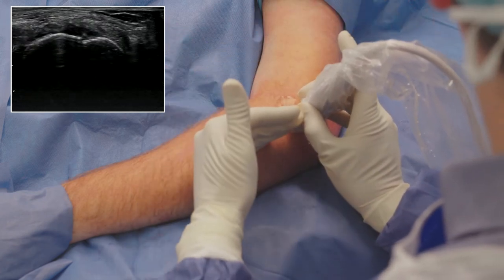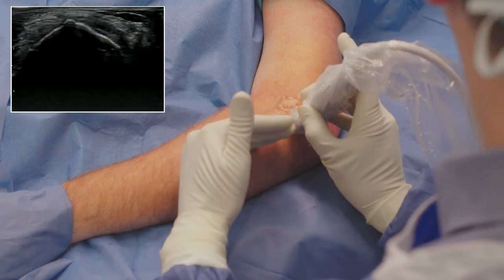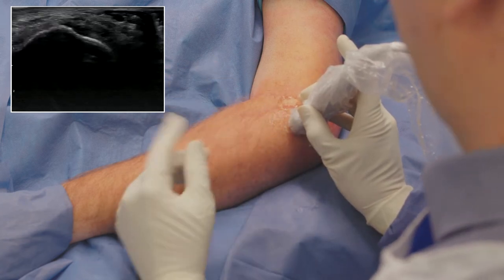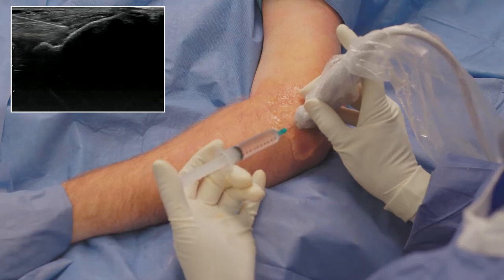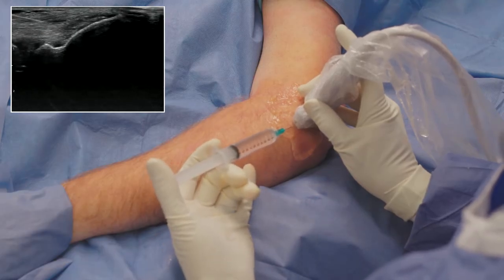As you can see on ultrasound, I notice a small hypoechoic area that I will target with TenJet. To ensure that the patient has minimal discomfort during the procedure, I administer a local anesthetic.